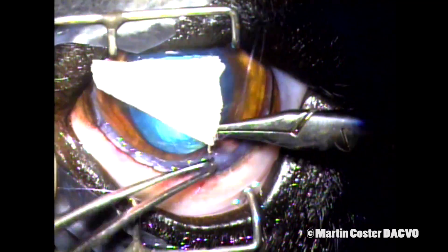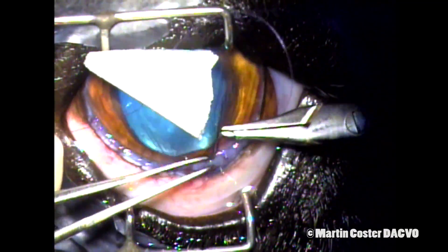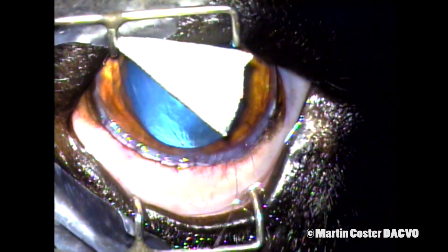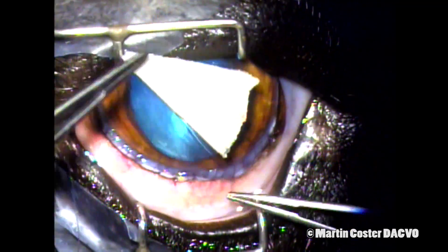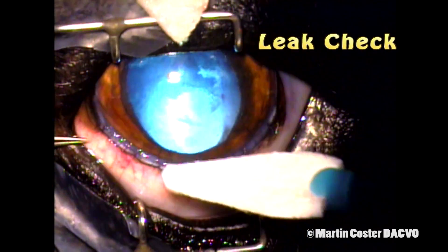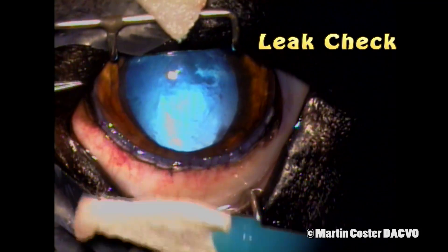This eye was left without a lens, so aphakic. Some surgeons might choose to place a sulcus intraocular lens, sutured in place, behind the iris. But this dog had excellent vision postoperatively, if blurry, and had good functional navigation. After the final suture is tied, we leak check the incision and check the tone of the globe — it is already reinflated with aqueous humor.